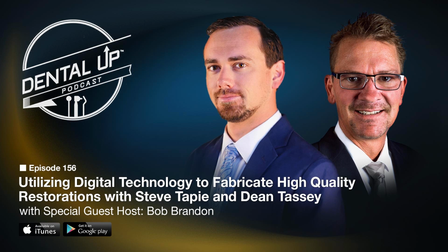Yeah, and time. Why don't you speak to how long it takes to mill one of the bases or a set of teeth versus the speed at which printing can accomplish the task. Right. So milling took hours and hours. For one arch? Yeah, for one arch. And if you multiply that over however many cases we would hope to have going into full production, it just wasn't feasible. The nice thing about printing is the printing time is determined by the height of the plate. So you can have multiple arches, and it's not going to change the overall printing time.